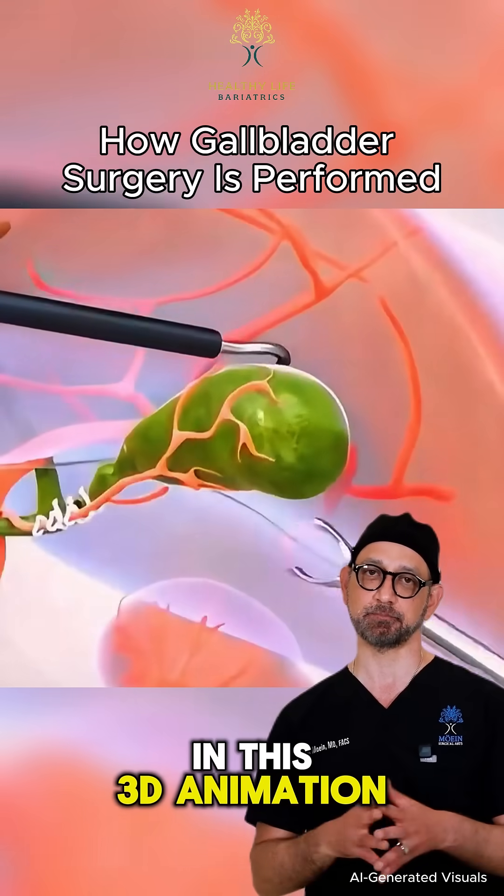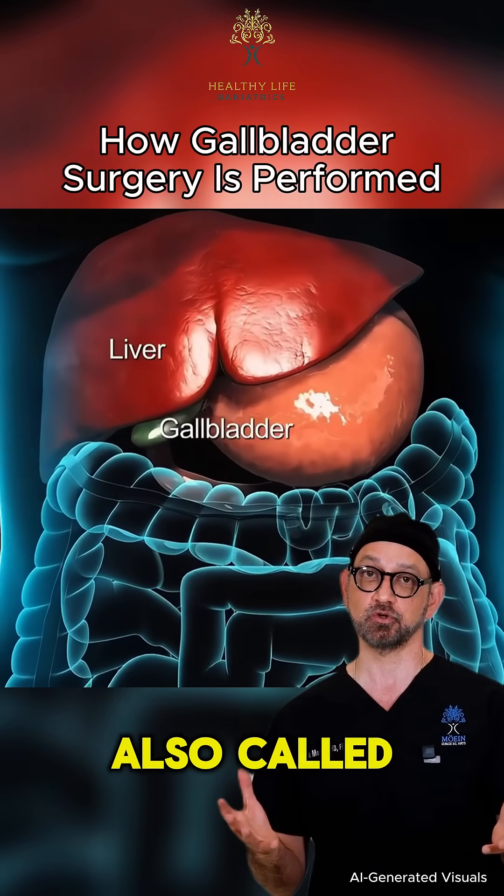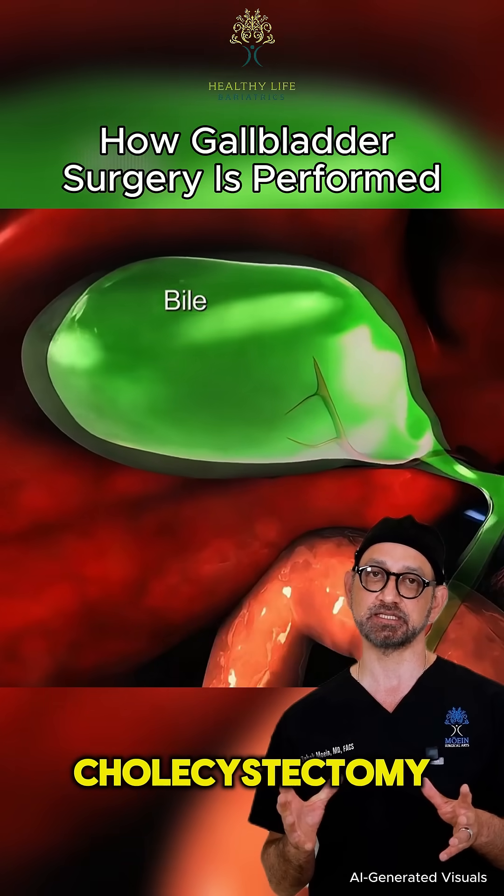Hello, I'm Dr. Mohan. This 3D animation will walk through how laparoscopic gallbladder removal, also called laparoscopic cholecystectomy, is performed.